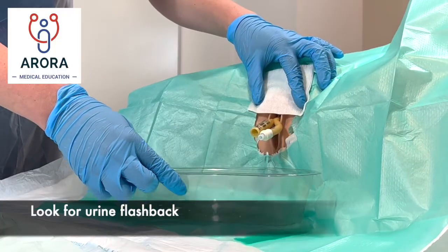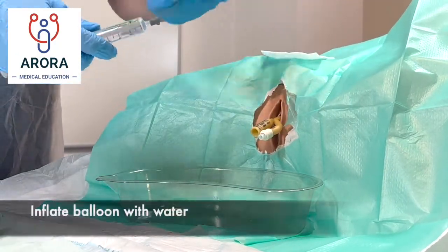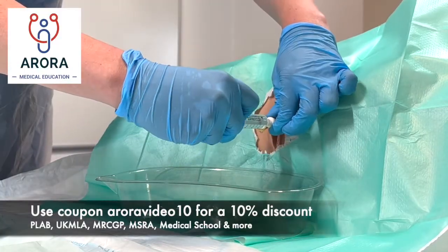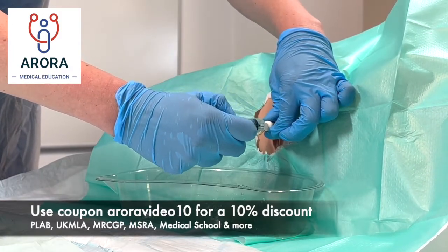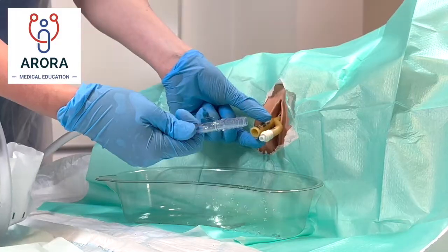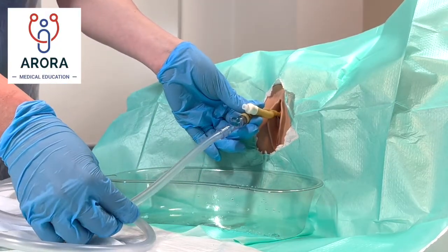Once the catheter is fully inserted, we'll get some urine flashback which we collect into the bowl. It's then time to inflate the balloon with water — warn the patient we're going to inflate the small balloon and to let us know if there's any pain. Insert the water into the tube to inflate the balloon. Now we can connect the catheter bag and the urine will start to drain down into it.